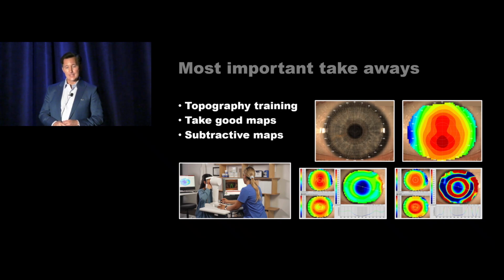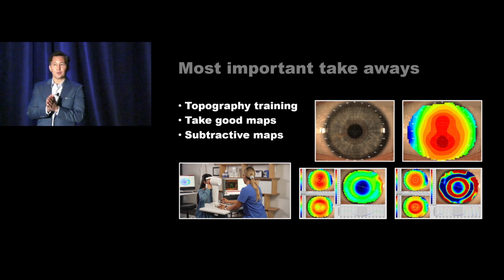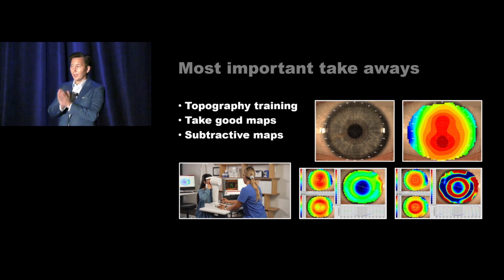And then this may be a lab question. Are you purposely choosing that 8-day follow-up because the labs have a doctor's change, like a one-time change, so you have to get all your information correct before you go back to the lab to tell them, look, I ordered this lens, but I did an 8-day follow-up and I really want you to make these changes? Yeah, so the follow-up schedule we typically use at the school is one night.